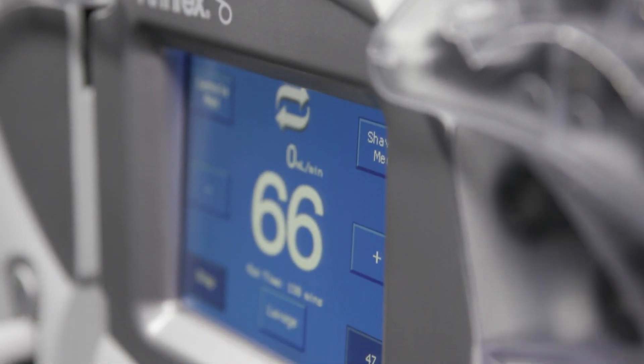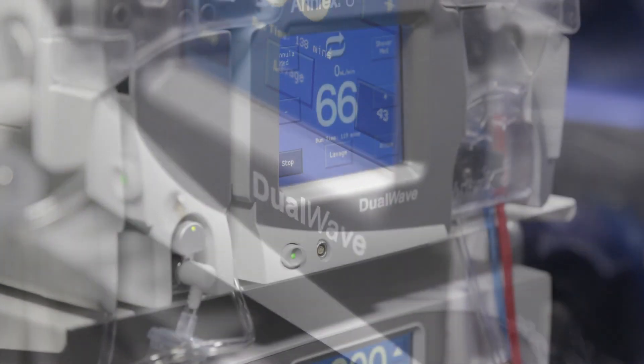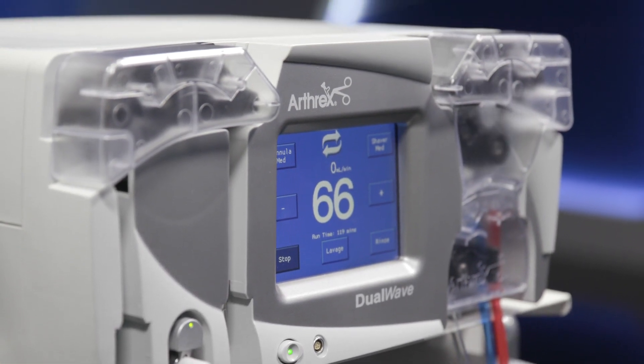It is recommended to use the lavage mode instead of increasing the pressure during the surgical procedure, because the lavage mode automatically returns to the original pressure setting. If the actual pressure setting is increased, it may not be lowered until swelling is noticed.